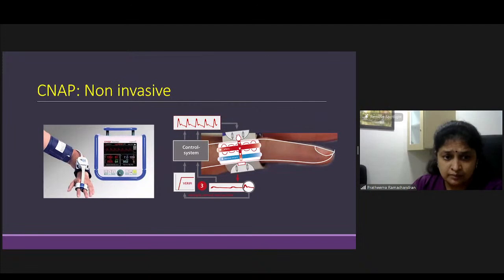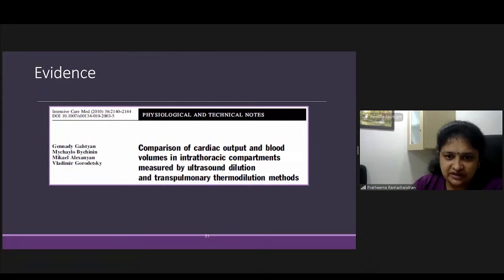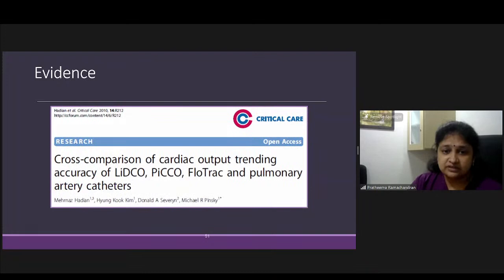But in ICU patients, it is still under study and it is not advised to use this in patients who are very sick and in severe shock states. So evidence, yes, we have a lot of studies which have been done comparing cardiac output and the blood volumes by ultrasound dilution and transpulmonary thermodilution. All these methods have been compared and there have been cross comparisons with LIDCO, PiCCO, FloTrac, PAC catheters.